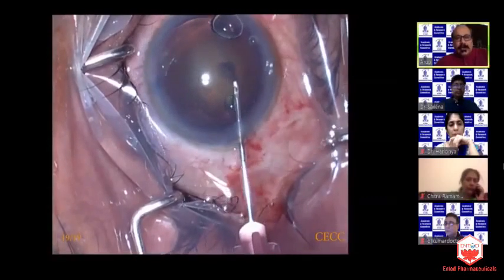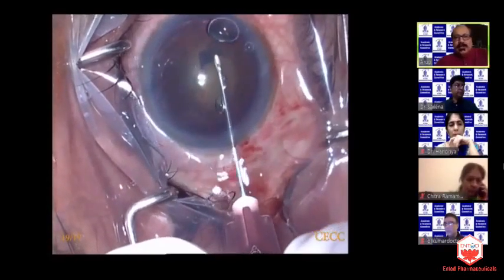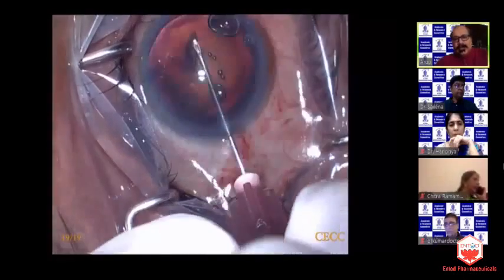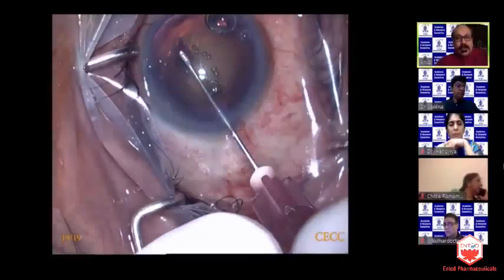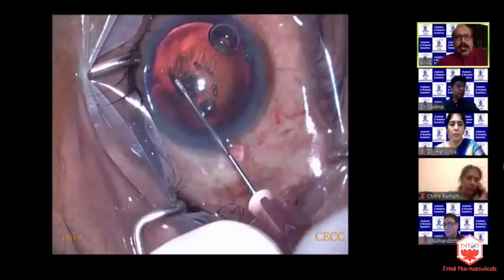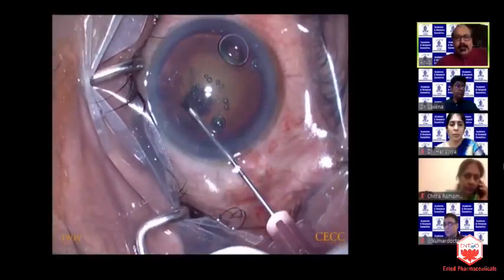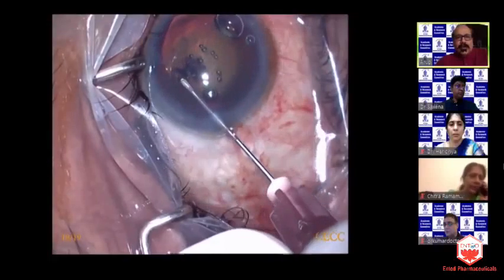or if the anterior chamber depth is less than 1.5 to 2 millimeters. But in this case, since the pressure was in the mid-teens and the anterior chamber depth was more than 1.5 millimeters, I did not give IV mannitol to start with. When you use IV mannitol, it is important that you give it 1 hour before surgery, and make the patient visit the toilet before the patient comes to the theater. But anyway, that wasn't done. And so far, so good.